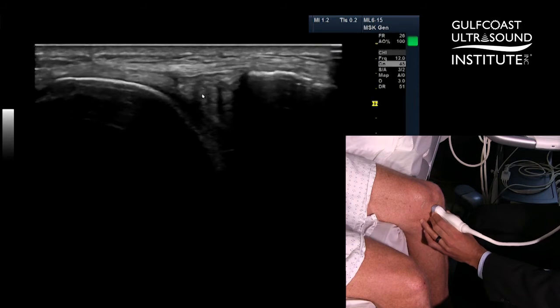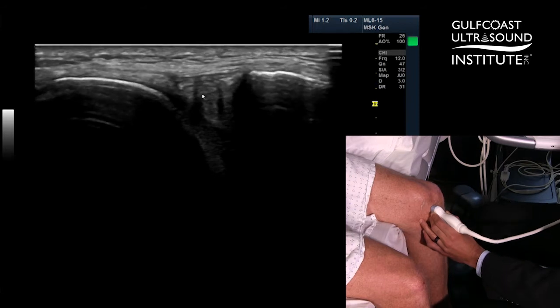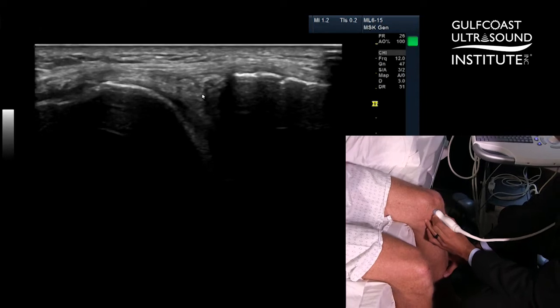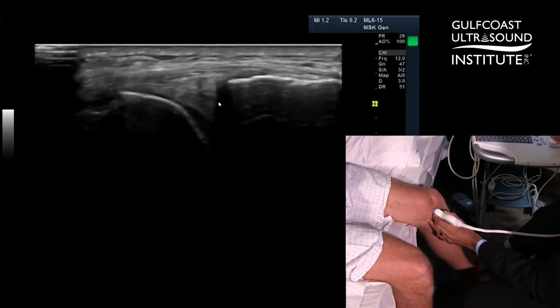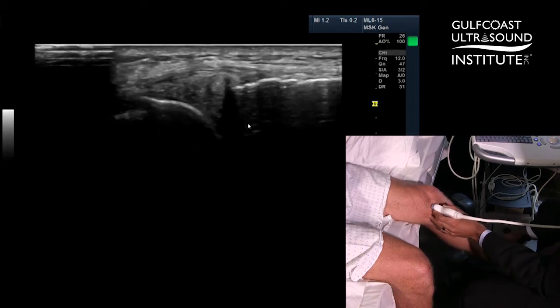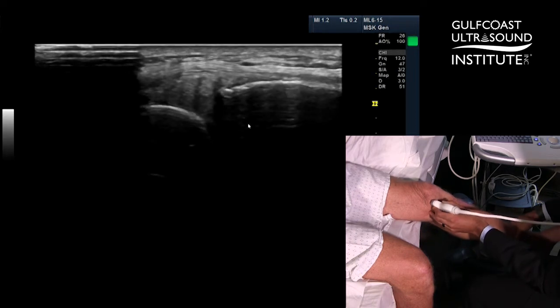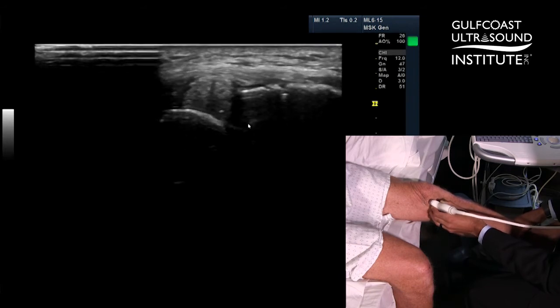Also, what you can interrogate for is using a dynamic evaluation to look for any subluxation of the medial meniscus. What we'll do is keep our probe centered on the meniscus and have the patient extend their knee, and we'll look for any subluxation of the meniscus outside of the joint. This will be a good determination of how much arthritis or joint space is preserved when the patient goes into extension of their knee.